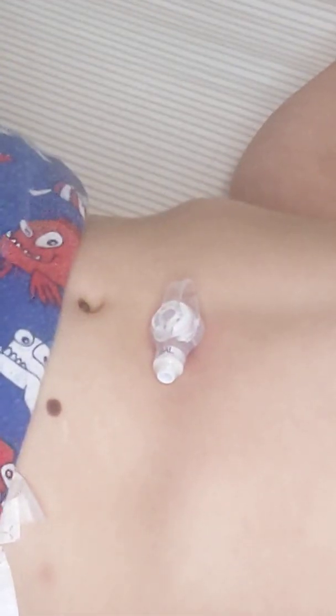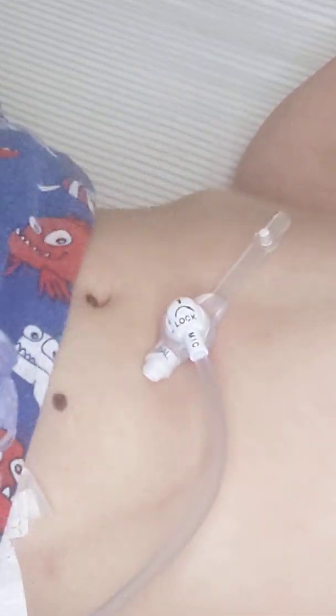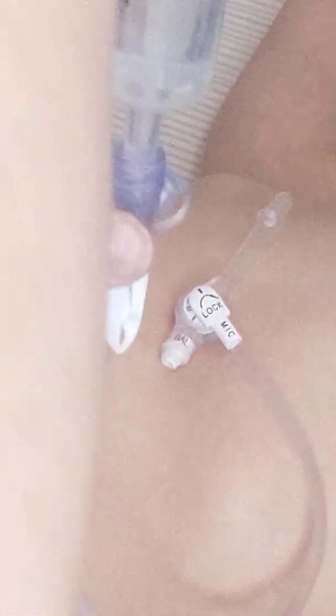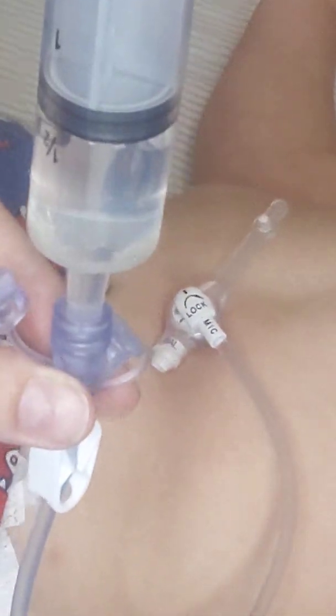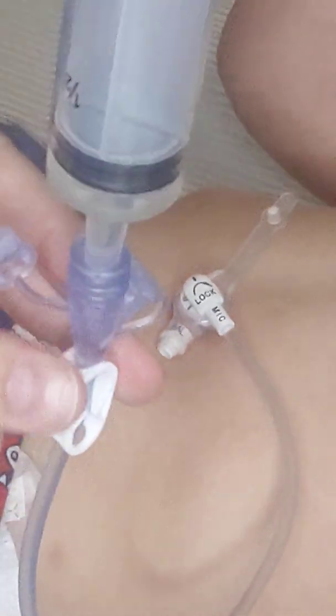Now, like I said, you want to check to make sure everything's flowing right as well. So you take that syringe off, you insert your Mickey tube, and you have your water over here. I draw up a little bit of water, about 30 or so ml. It doesn't have to be perfect. Put that into the little port. Now we're going to check that everything is flowing right. And as you can see, everything looks good. Water's going through easy.